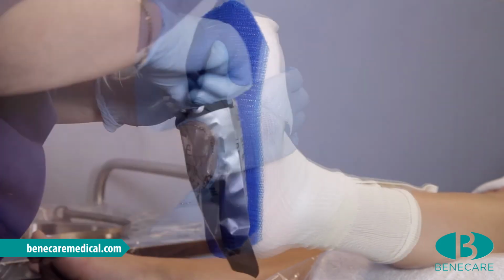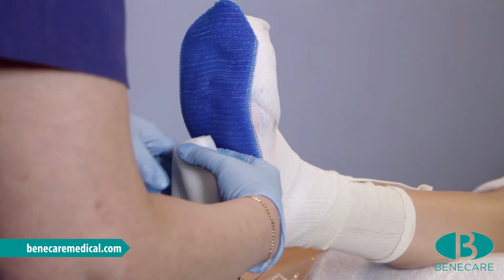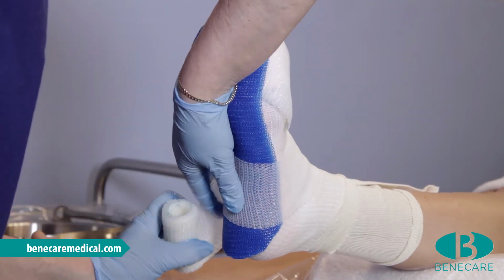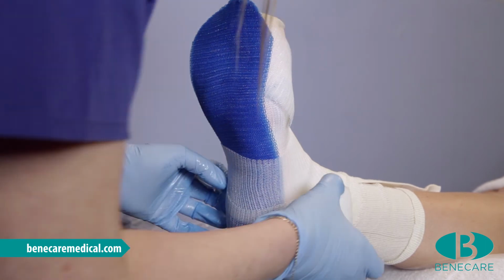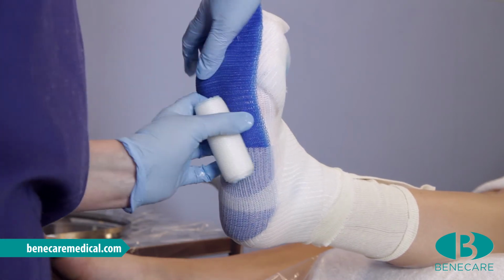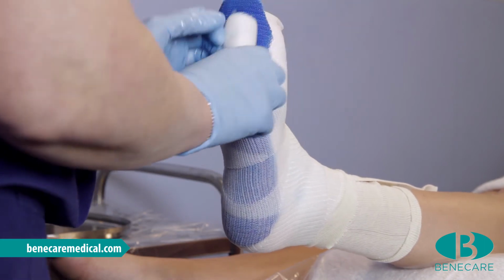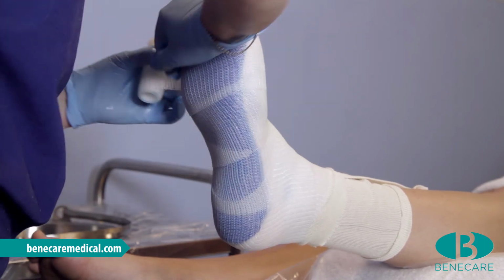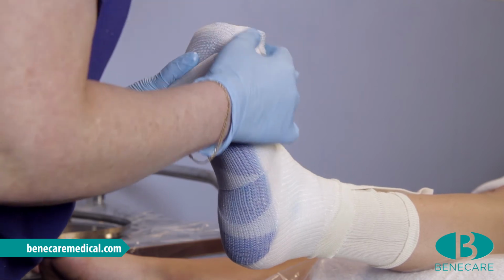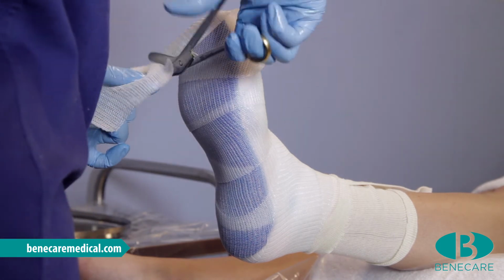Using the remainder of the Benecast Flex from the pouch, I will start to bandage at the proximal aspect of the calcaneum. I will work proximal up the foot to the tendon Achilles, then work diagonal across the dorsum of the foot from where I originally started. Then continue wrapping, working towards the toes. Now fold the casting material back on itself, capturing the whole of the toes. Cut off the material.